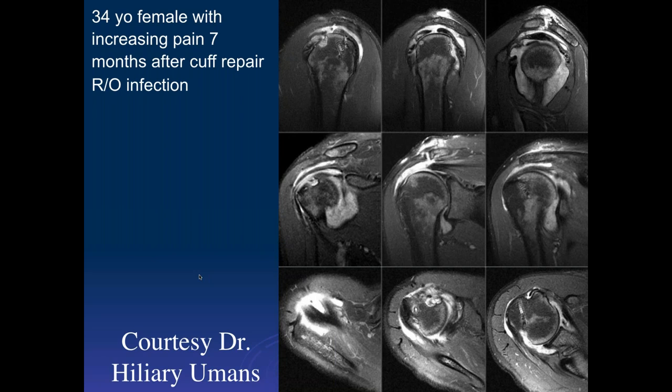How rapidly do you get a... Okay, so you have an effusion. What else do we have here? We have the rotator cuff tear. What else? There's some synovial thickening or debris possibly inferiorly. Yeah, there's an erosion, but again, erosion also could be from infection.